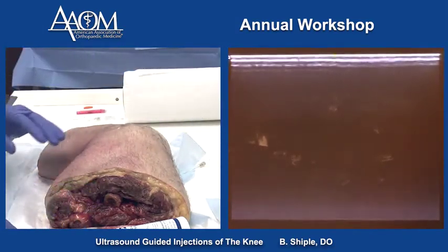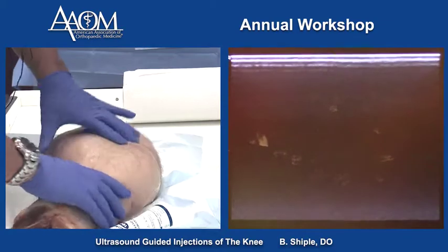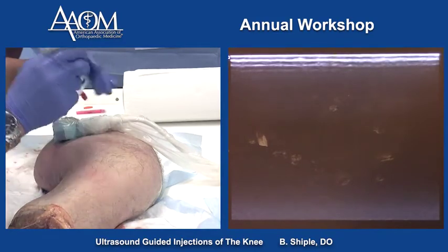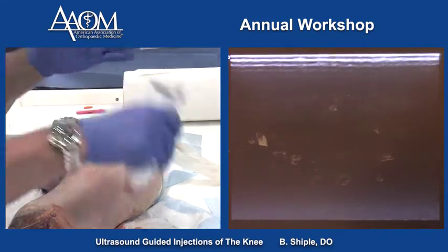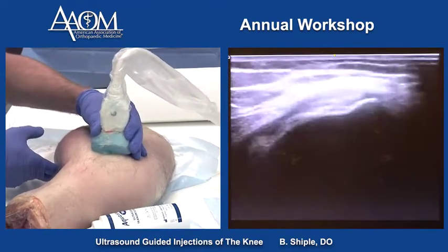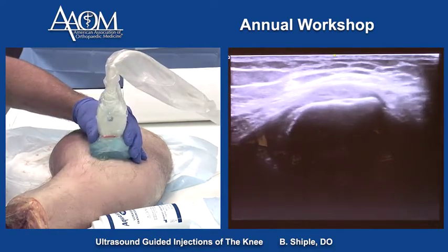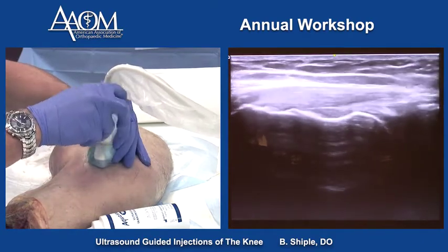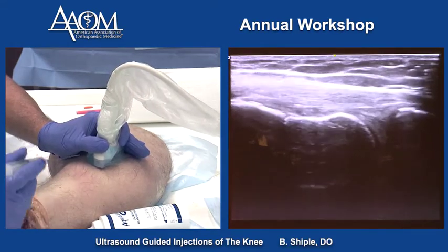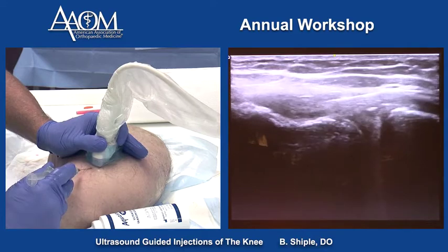Next is the medial aspect of the knee. To find the adductor tubercle where the MCL originates, we use the short axis slide from the VMO down. You'll see the femur rise up — that's the adductor tubercle. Once we're in the body of the MCL, we pivot the probe 90 degrees. Now we have the MCL lined up perfectly and can inject the MCL in long axis. That's my needle placement into the MCL.